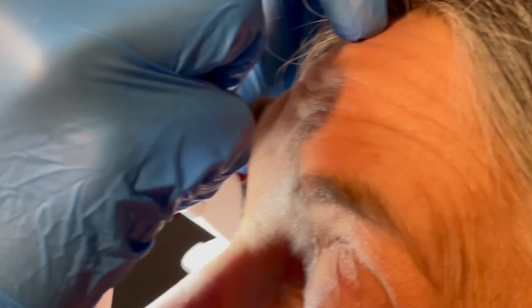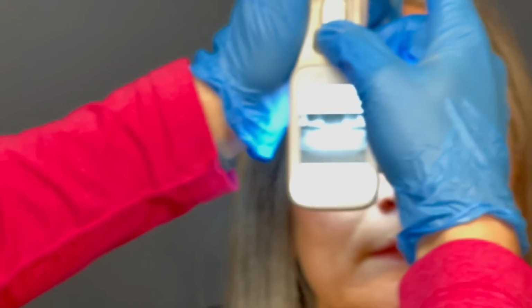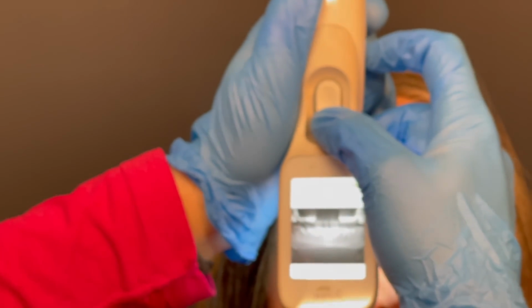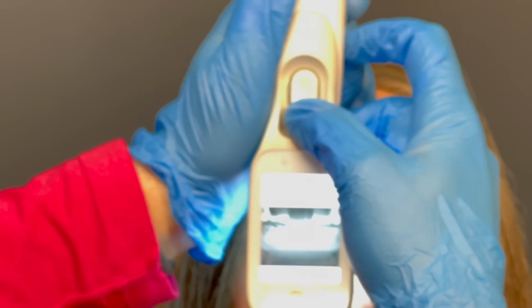Ready. Lean your head back, look down toward your toes this time. So we just invert the instrument, flip it upside down to catch that upper lid. Grab the upper lid, go ahead and close your eyes for us. And then we just let it do the same thing again, hold it in place. And 30 seconds in. And you're now 40 seconds in, so we're going to push all that nice melted oil to the surface.